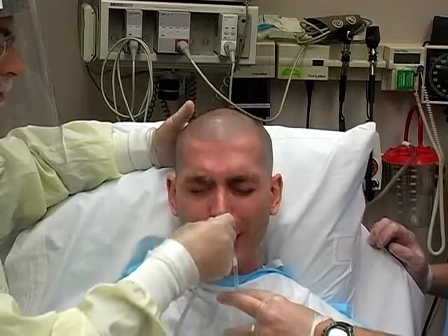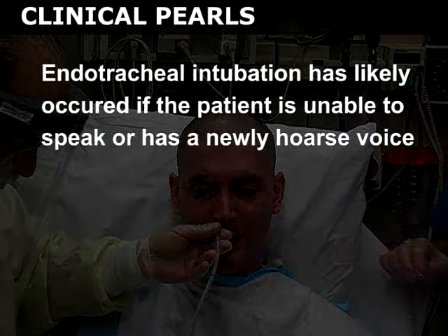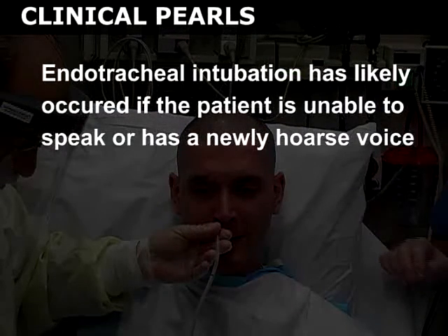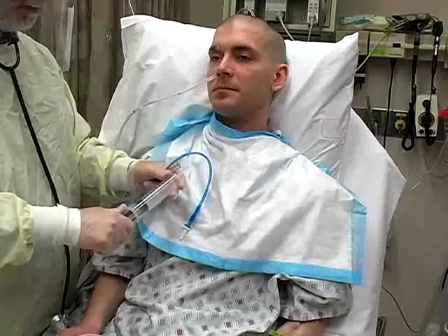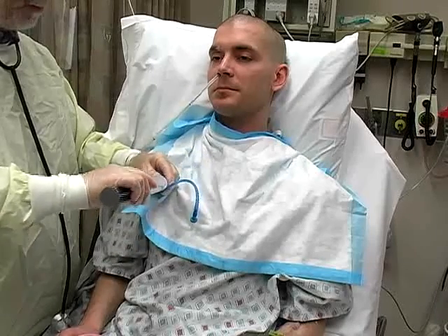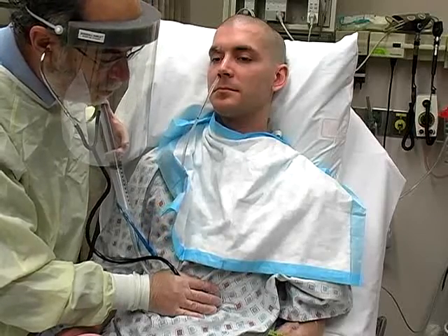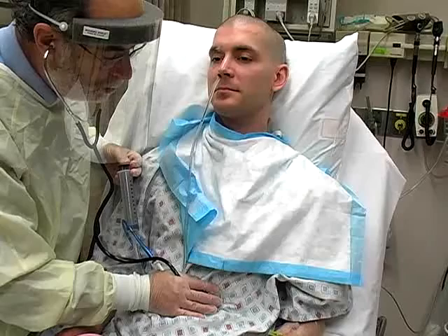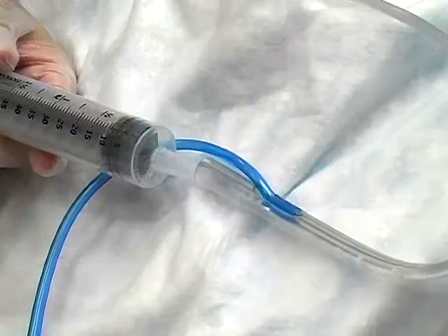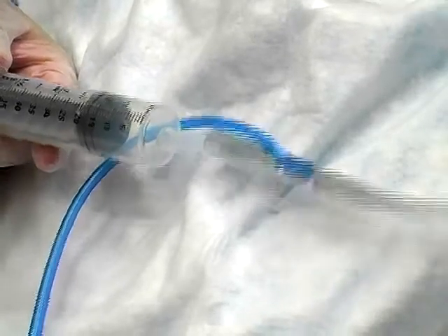First, assess proper tube placement by asking the patient to speak. Endotracheal intubation has likely occurred if he is unable to speak or has a newly hoarse voice, and the tube should be removed immediately. Next, auscultate over the epigastrium while infusing 30 milliliters of air into the tube with a catheter-tipped syringe. The presence of borborygmi suggests proper placement in the stomach. The same syringe can also be aspirated to check for return of gastric contents.